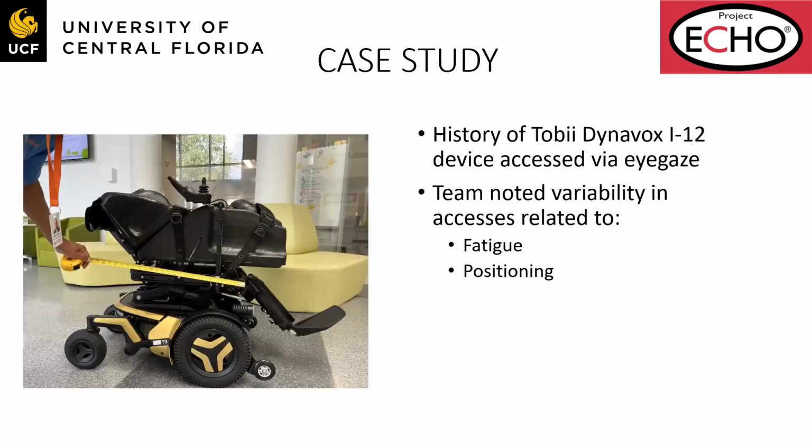And so in the process of evaluation time, there is this wheelchair, which he is actually positioned prone in. This is brand new. It hasn't actually officially been delivered to him yet. We were taking measurements for his communication device access. So he had an I-12 when we began the evaluation that he had been using for the past 5 to 6 years.